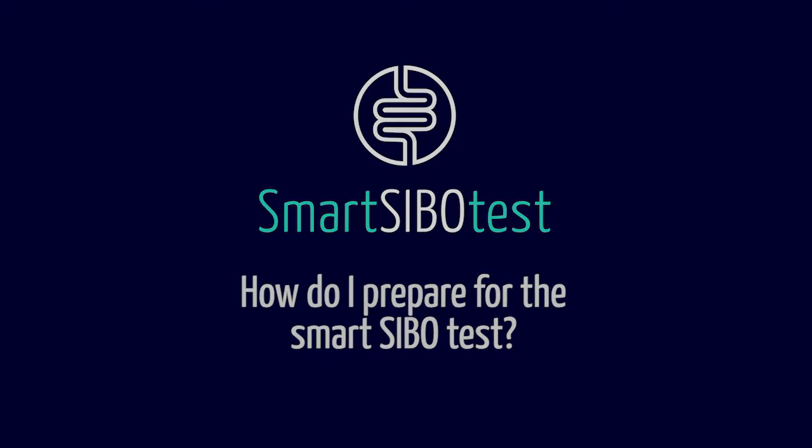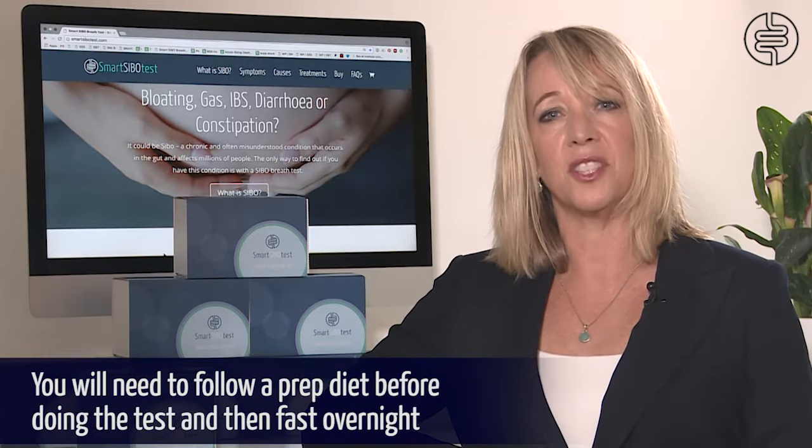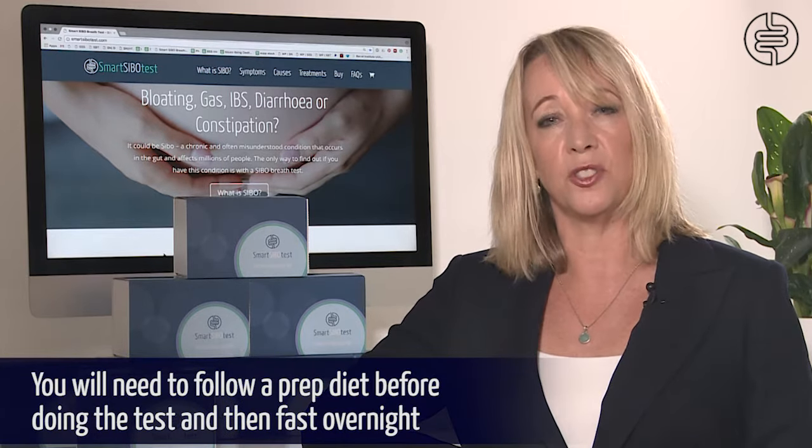In order to do the SMART SIBO breath test you need to follow a prep diet for the day before the test. However, if you suffer from constipation, we recommend you follow the prep diet for two days before doing the test. The prep diet is a simple low fiber diet, for example chicken and white rice. Your kit will come with full menu ideas and instructions. After the prep diet you need to fast overnight, but you're able to drink water during this time.